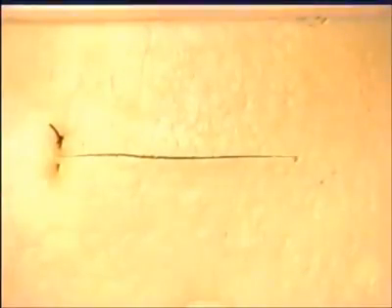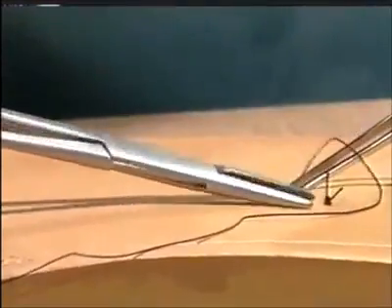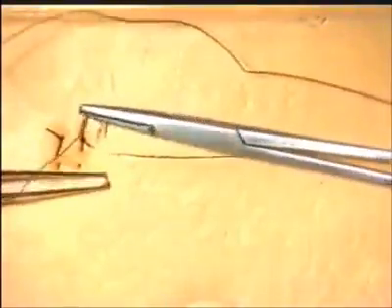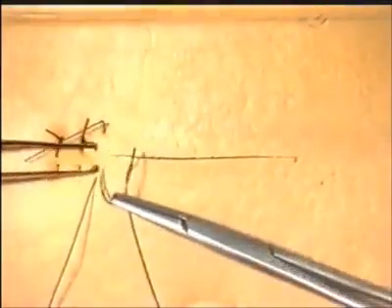A second vertical mattress suture is inserted. The suture is placed. The needle then reversed in the needle holder, and then, go back, taking just a few millimeters of skin edges. The knot is then tied, and the suture material cut. Let's insert just one more vertical mattress suture. In at right angles. Reverse the needle. And then, going back. Just taking the wound edges as seen.